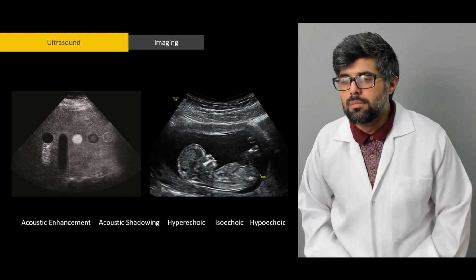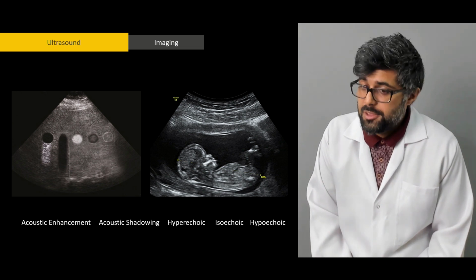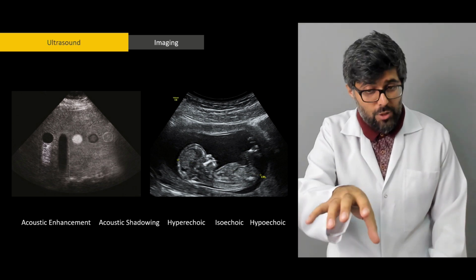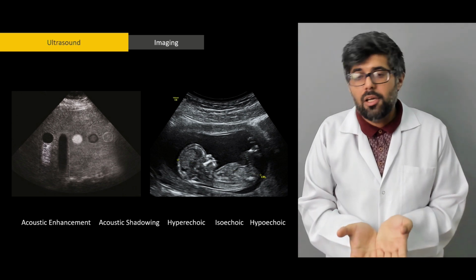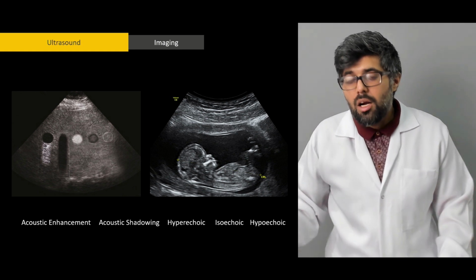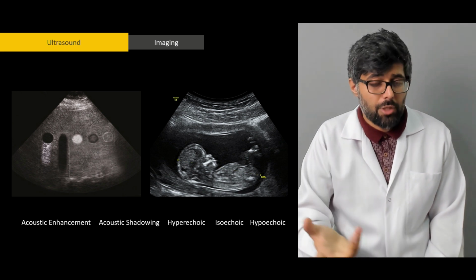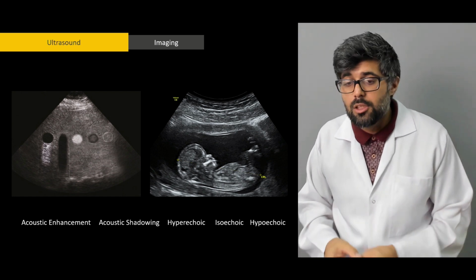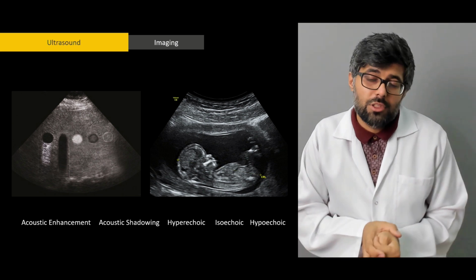Now here is an example of a typical ultrasound. This ultrasound image is of a fetus in the mother's womb. You can appreciate the fluid-filled cavity, the amniotic fluid in which the fetus rests, and that it is surrounded by a layer. That layer is the uterus. So, again, ultrasound works best for water-filled areas, such as during pregnancy, pleural effusion, and synovial joint studies. So water-containing structures are ideal for the modality of ultrasound to be used.